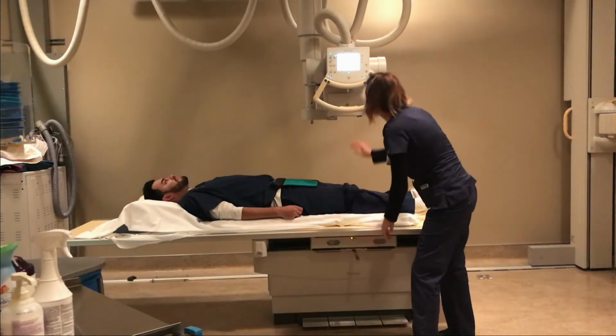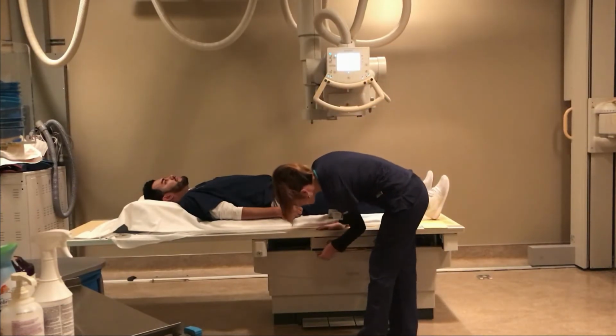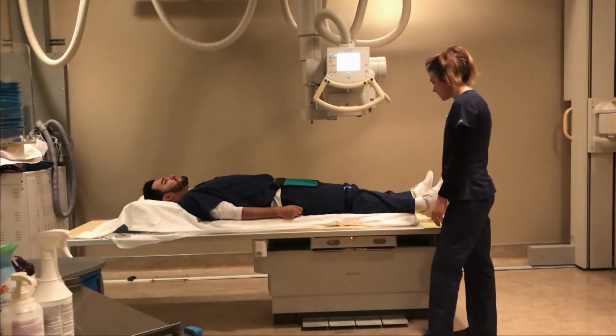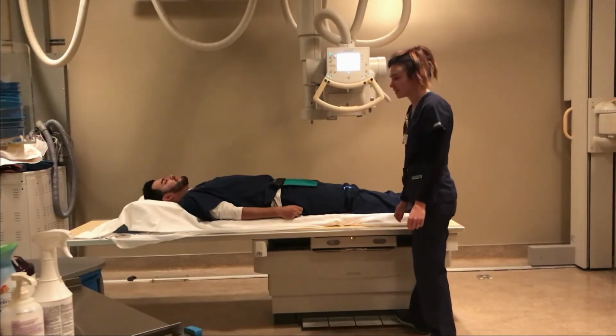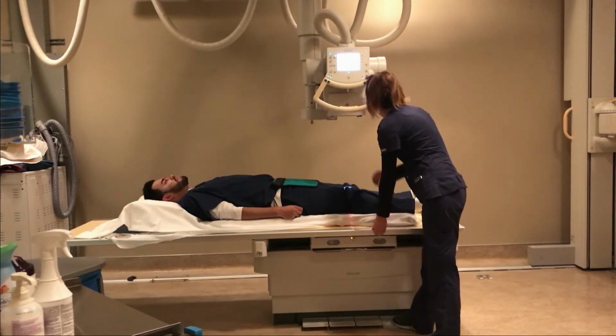Make sure that that's good. Okay. So for the first projection, it's the AP projection of the knee, and the central ray is going to enter 1/2 inch below the patellar apex.